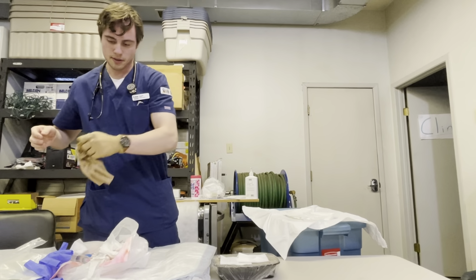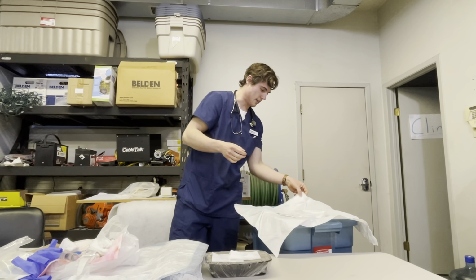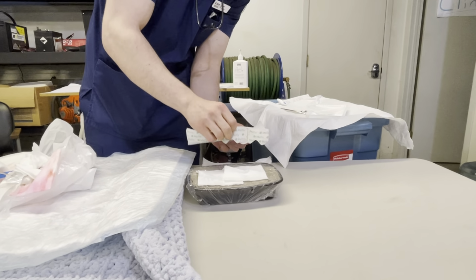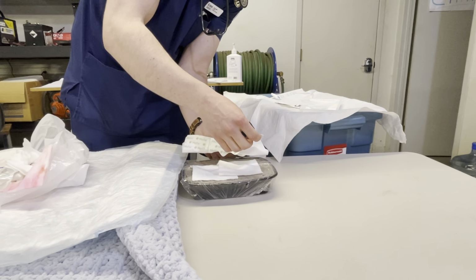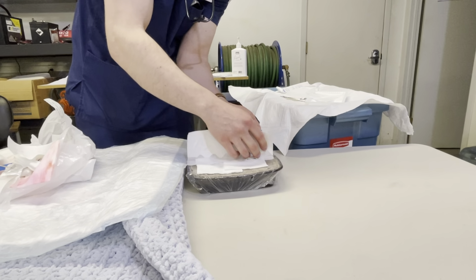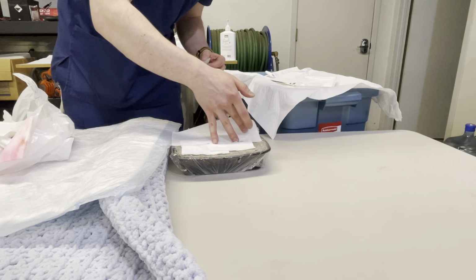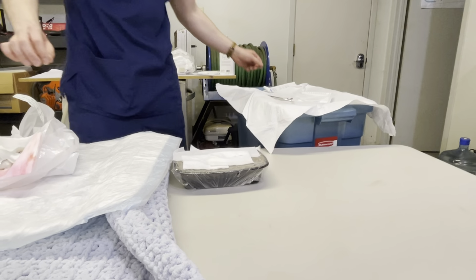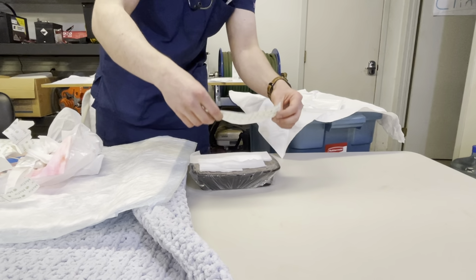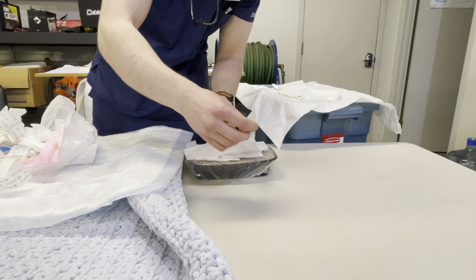Now that that's on, I'm going to take my gloves off. I'm going to do hand hygiene, and I'm going to take our Mefix, which we're going to be using to cover the wound. I'm going to start with this side. Put it about like so. And the other side. Like so.